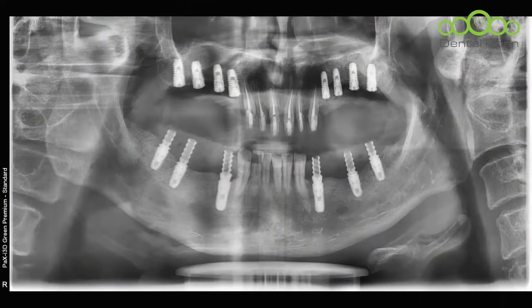I'm back. I finished the surgery as I planned. There was some unexpected situation, but generally, as I expected, surgery went well. Then I want to show you the panoramic radiography of this patient. Okay, this is the post-op panoramic radiography. On the right side, I performed the minor bone graft only on number 6. So it is not clear, but maybe some bone is inside of the sinus.